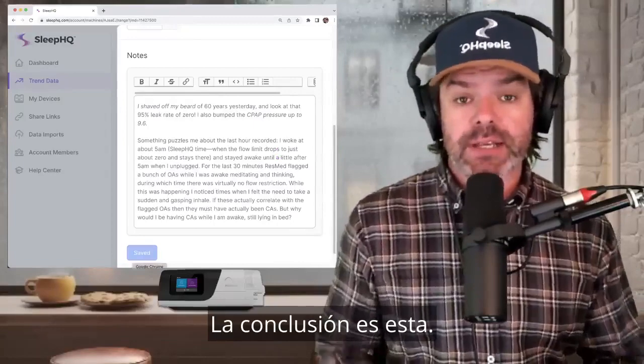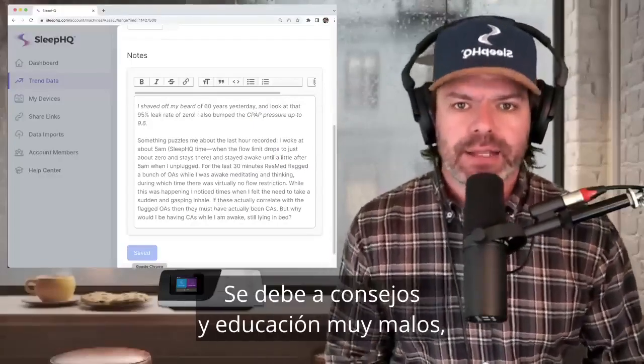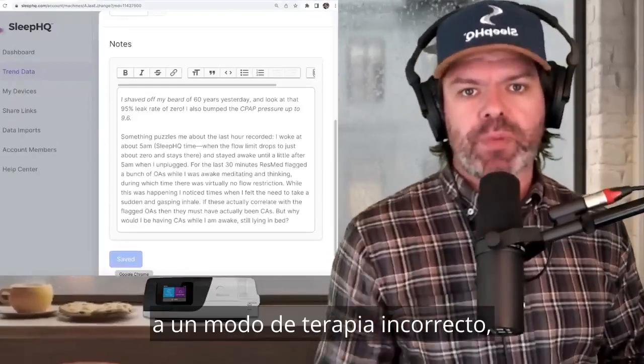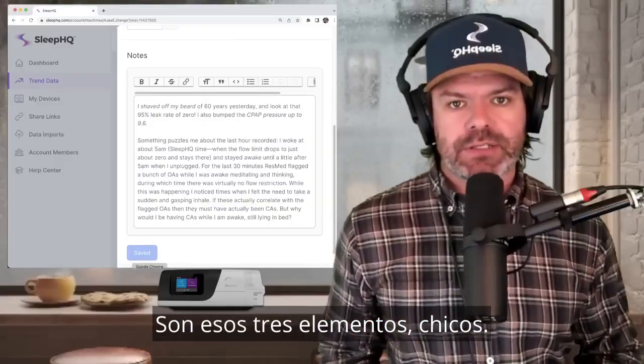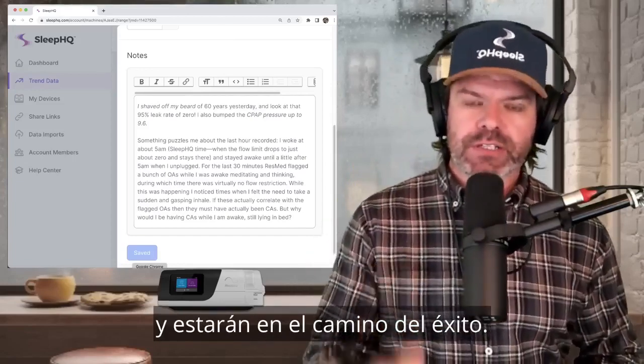The bottom line is this: the reason people fail CPAP is not because it's hard. It's terrible advice and education, wrong therapy mode, incorrect pressure settings, poor mask choice. They're your 3 elements, guys. Get those 3 things right and you are on the road to success.